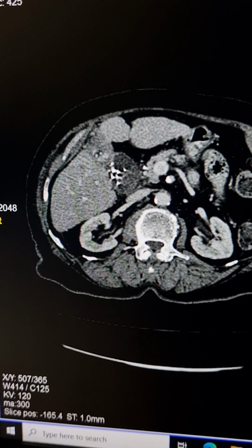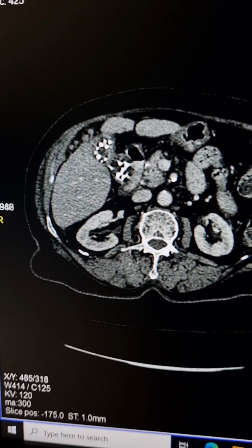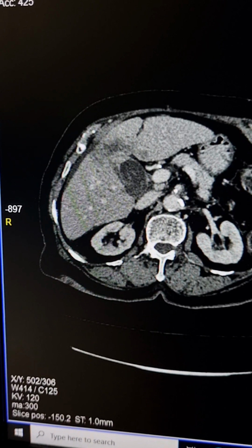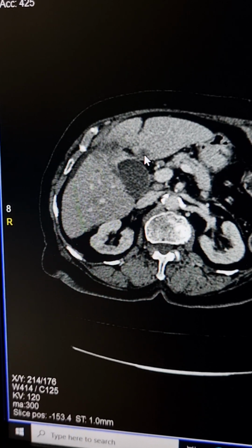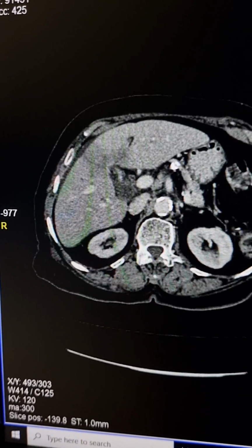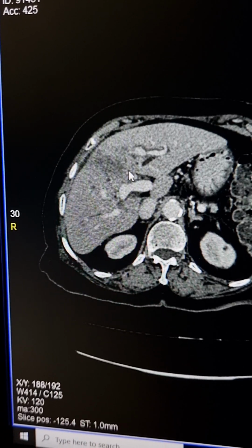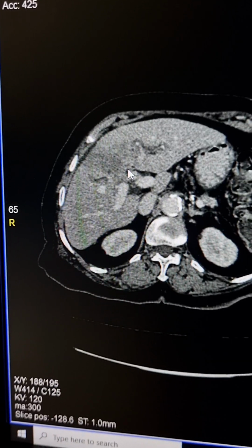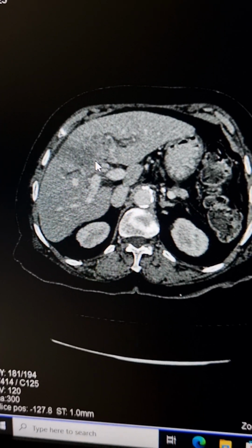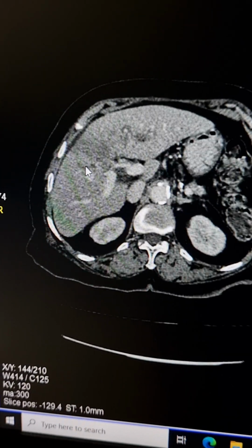Now, these are the metastatic lesions along the outer surface of the right lobe of the liver. Now, this mass, this again is a metastatic mass here. This mass extends upwards up to the porta hepatis. Here at this level, this is the level of porta hepatis. It has involved both hepatic ducts, resulting in mild dilatations of intrahepatic biliary channels. Now this is the dilated intrahepatic biliary channel in the right lobe of the liver.